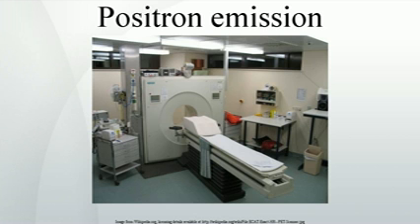These amyloid imaging probes permit the visualization of amyloid plaques in the brains of Alzheimer's patients and could assist clinicians in making a positive clinical diagnosis of AD pre-mortem and aid in the development of novel anti-amyloid therapies.